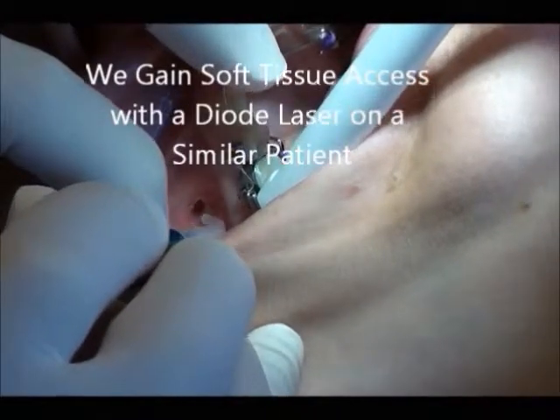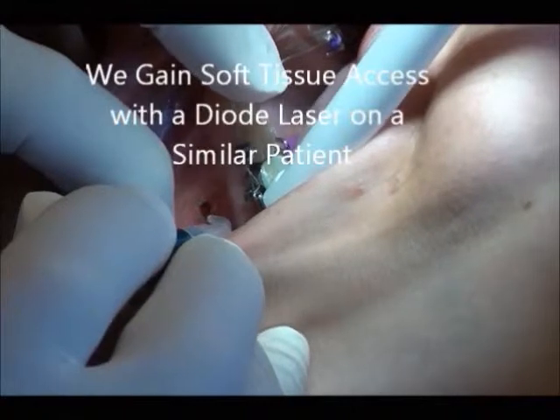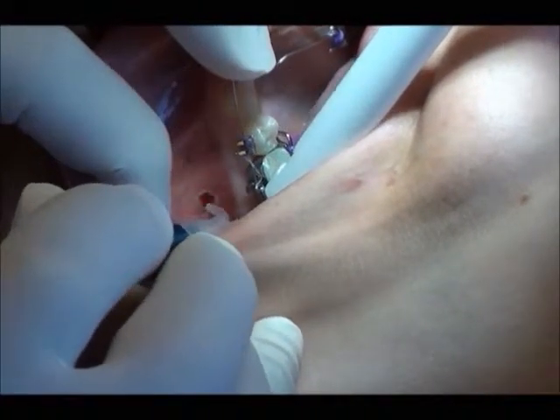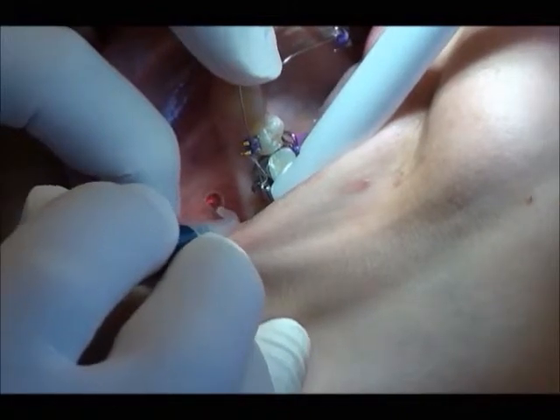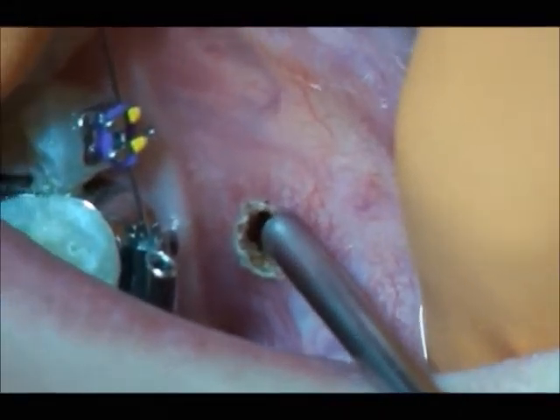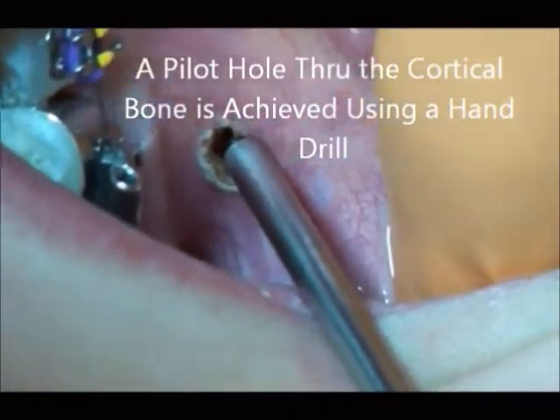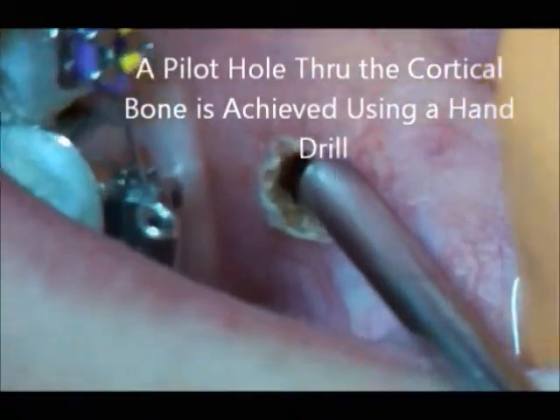We gain soft tissue access with a diode laser on a similar patient. A pilot hole through the cortical bone is achieved using a hand drill.